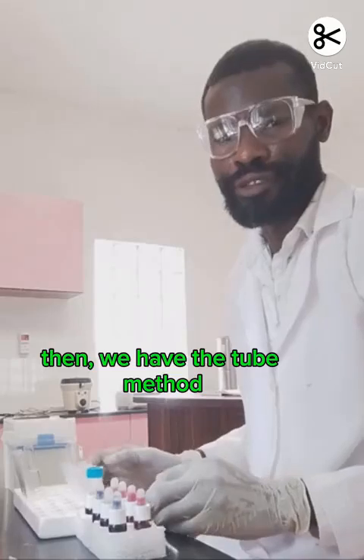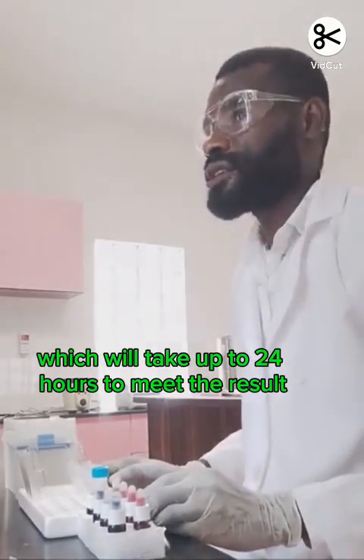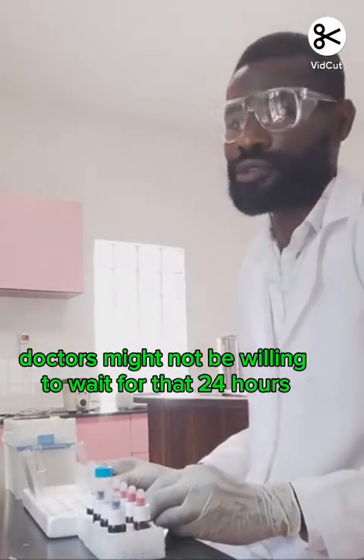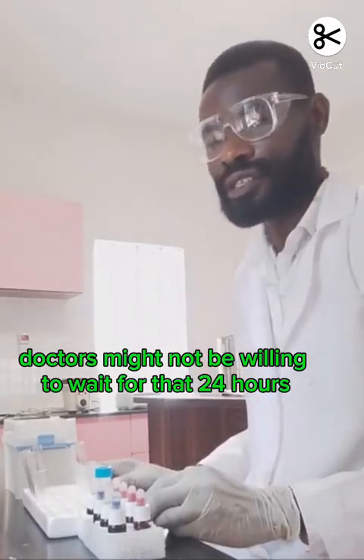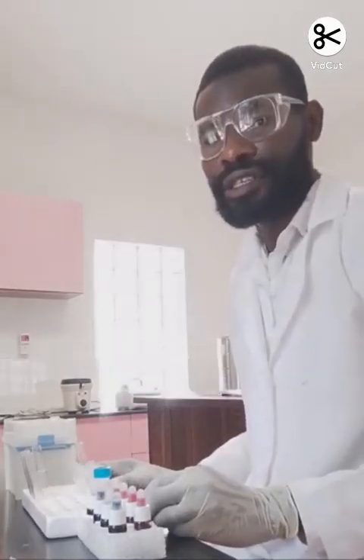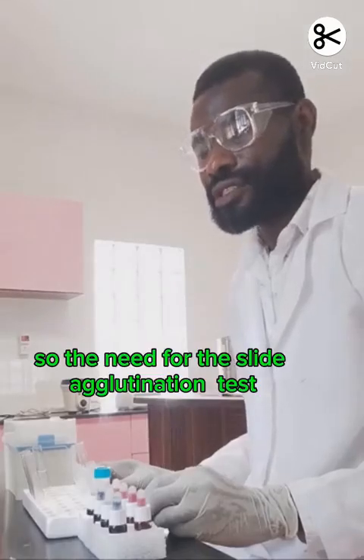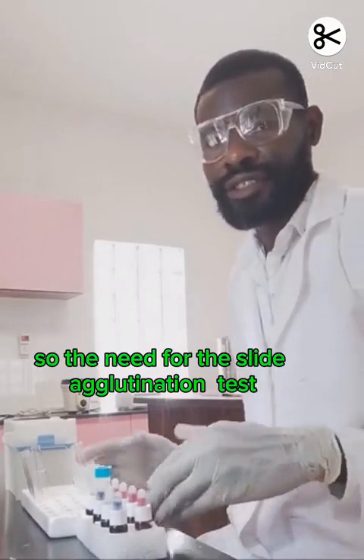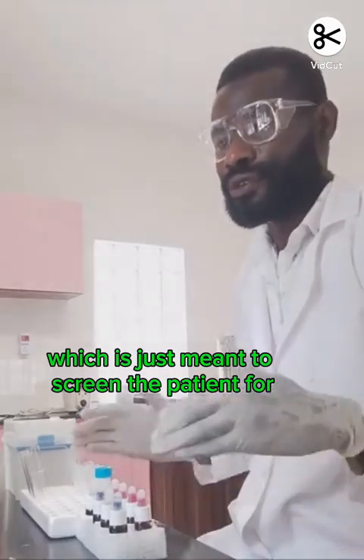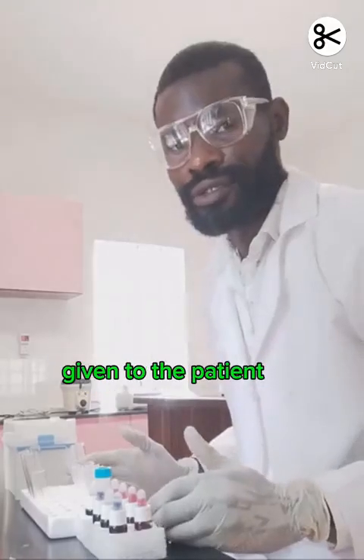Then we have the tube method, which will take up to 24 hours to read the result. Based on the fact that this is just a screening test, most doctors might not be willing to wait 24 hours for the test result to be ready in order to effect treatment on the patient. Hence the need for the slide agglutination test, which is just meant to screen the patient for whatever treatment modality will be given.